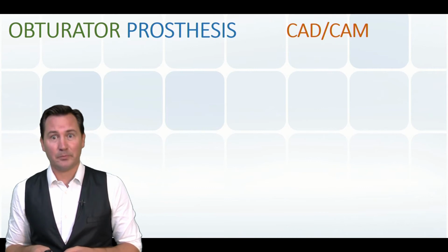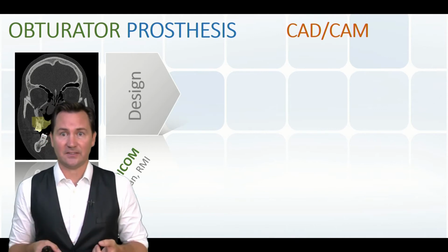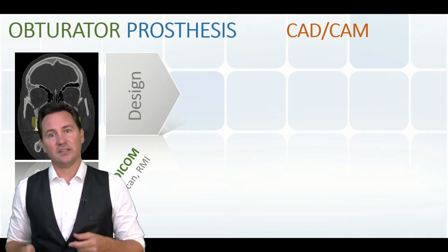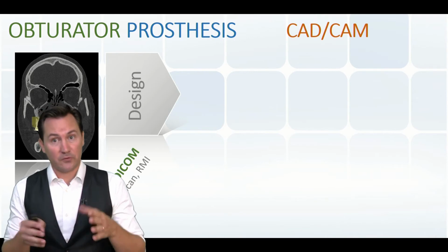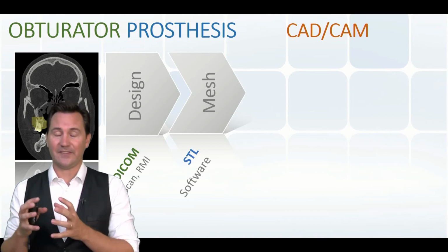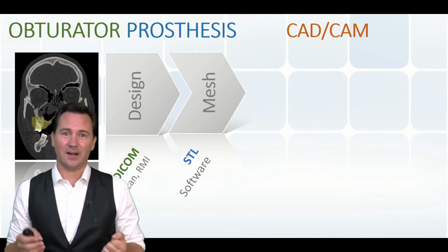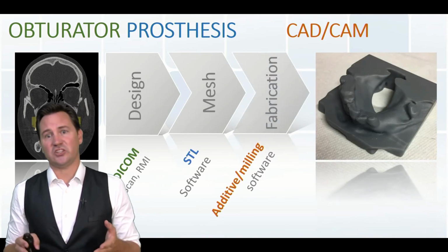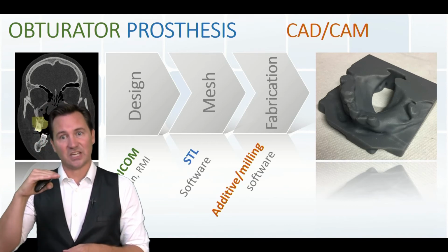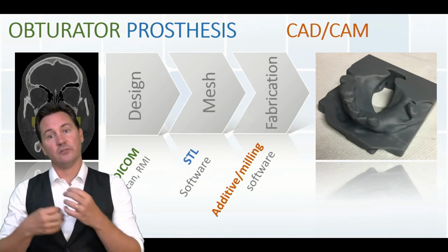As a brief reminder, the particularity of medical CAD-CAM is that we work from the patient's digital imaging files, often DICOM or PLY files. Then we digitally design a personalized object, or we perform a segmentation of this imaging file. The second step is to convert them into a 3D file by creating a digital mesh, so we need specialized software to produce the 3D files. The last step is fabrication, and it begins with another software in charge of either digitally slicing the object into layers for additive manufacturing, or preparing the grinding of a block for milling technologies.